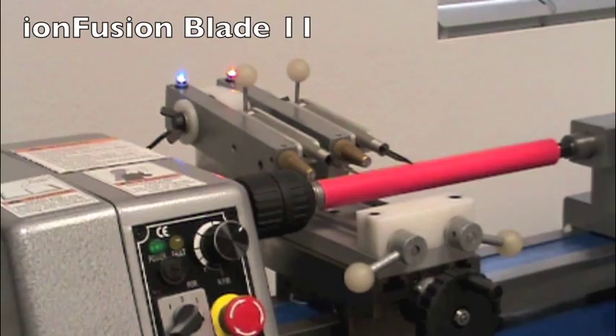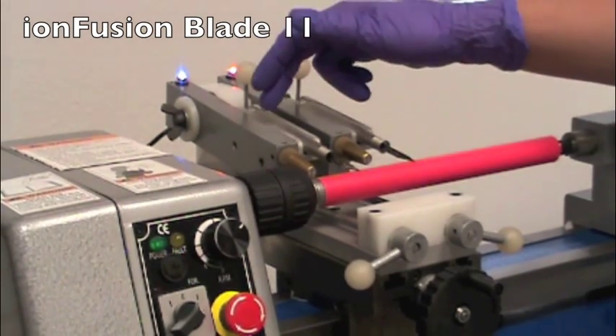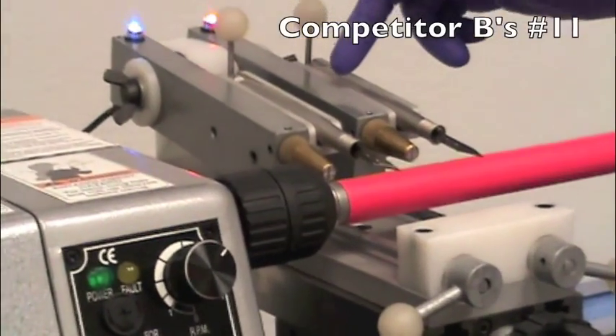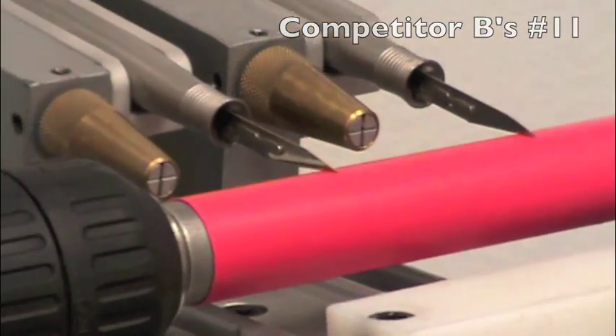In this test, we have the Ion Fusion number 11 scalpel blade on the left and competitor B's number 11 scalpel blade on the right. I will now start the test.